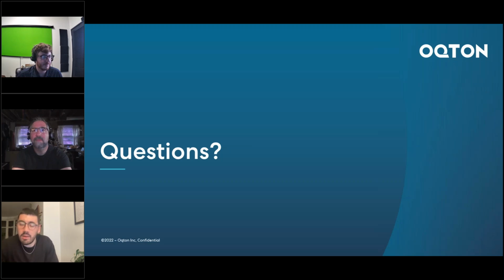Great, thank you. There's a question that's just come in about the Dynabot. Which versions of Freeform is the Dynabot available in? So Dynabot is available in Freeform Plus only.